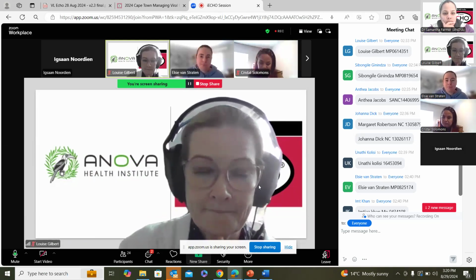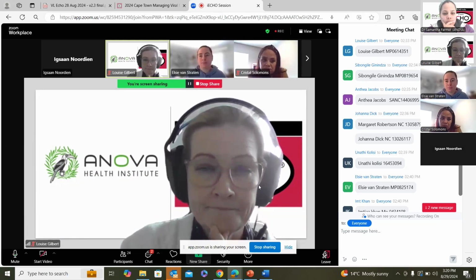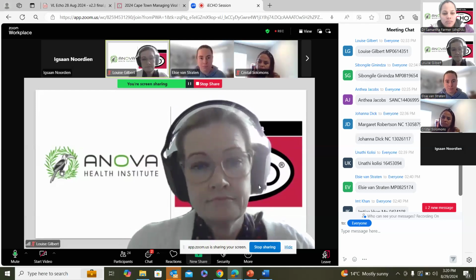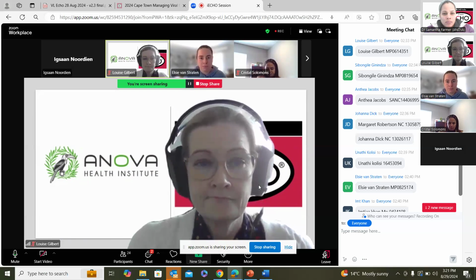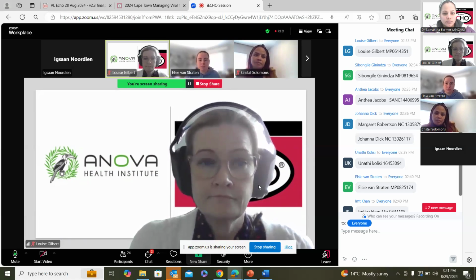Well, I don't know about not hemolyzing it. You're going to have to take the right lancet and the right depth to get that drop of blood. But then when you're scooping up and you've got that first drop of blood sitting on the lip of that scoop, take the microtainer and tap it gently onto a hard surface. That will push the drop to the bottom, and it also allows a certain amount of turbulence in the tube that lets it mix with the anticoagulant that's in there. When you're done with that first tapping, take the second drop, do the same thing, third drop, tap, and then collect it between 400 and 500 microliters.